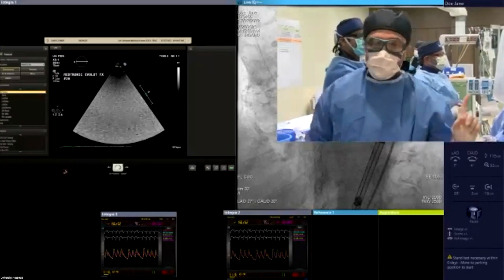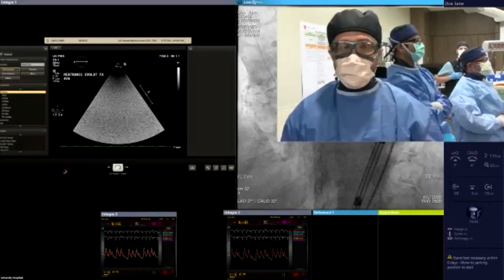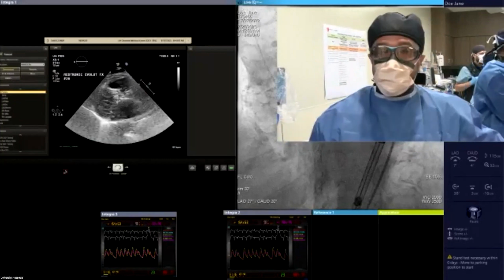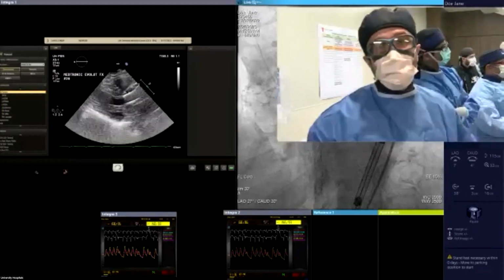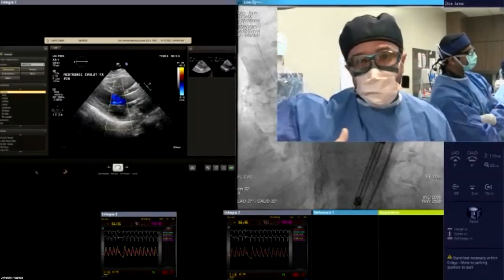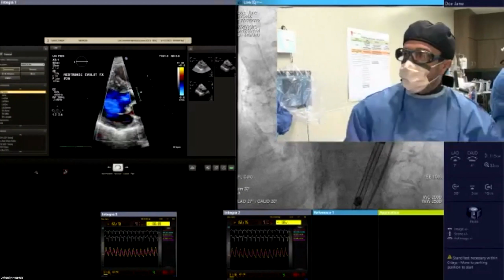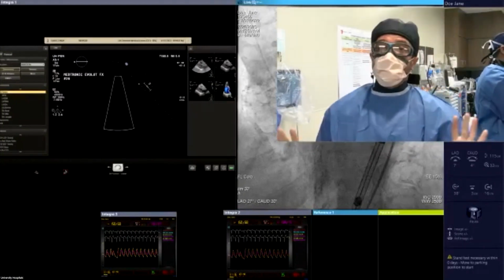When we were at 80%, you notice that I kept pacing rather than turning the pacemaker off. Why? Because her perimeter is around 72, almost 73. So she's in the upper end of the 26 valve. And at 80%, I don't like to stop the pacing fully at that point, because sometimes it ejects the valve. Remember, the valve is still at 80%, and the oversizing is not as much. So in this situation, we keep pacing to keep the systolic around 100. That's why I kept pacing.